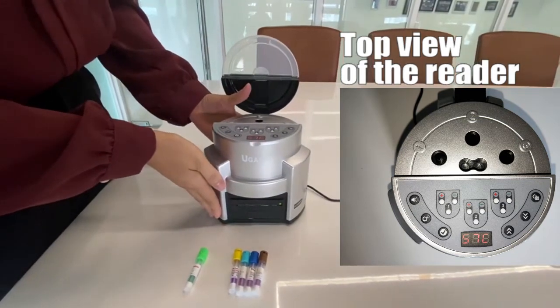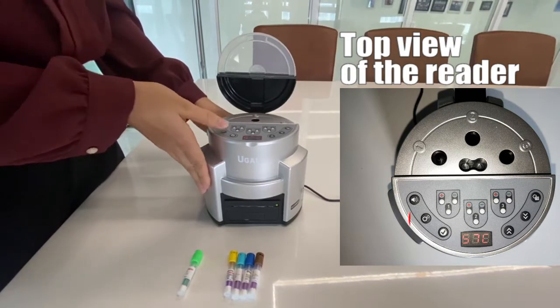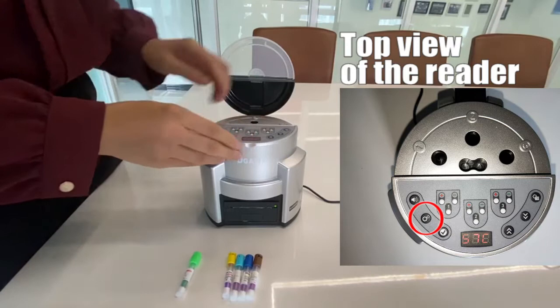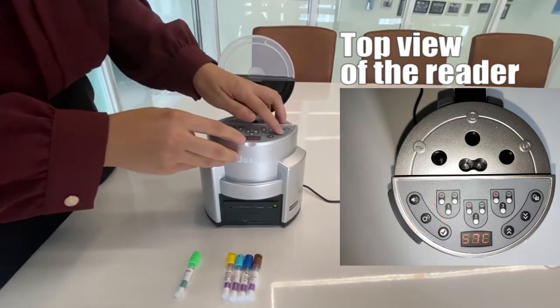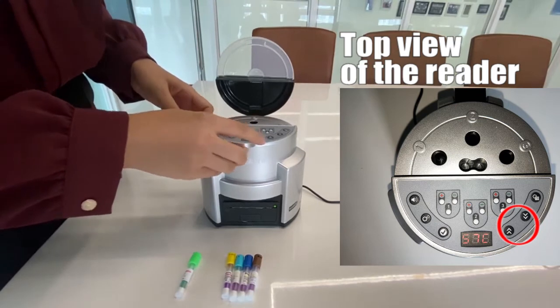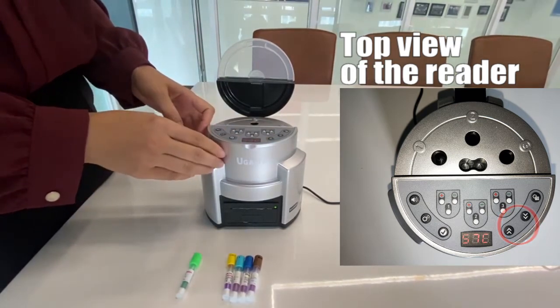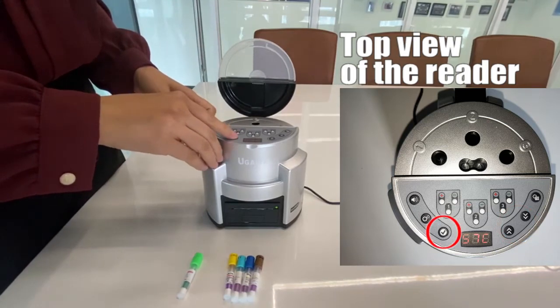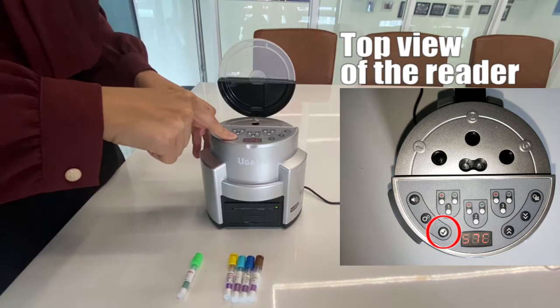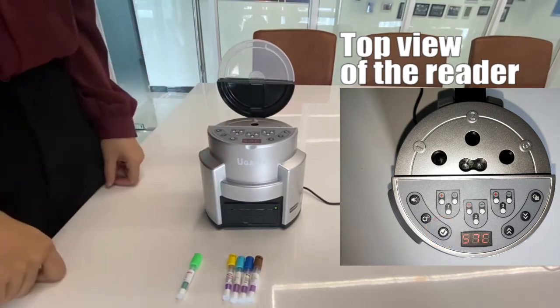Let me introduce how to set the temperature. Press this button. You will see it is blinking and we can choose 37 degrees centigrade, and the other mode is 58. Press here for confirming. Now it's okay.